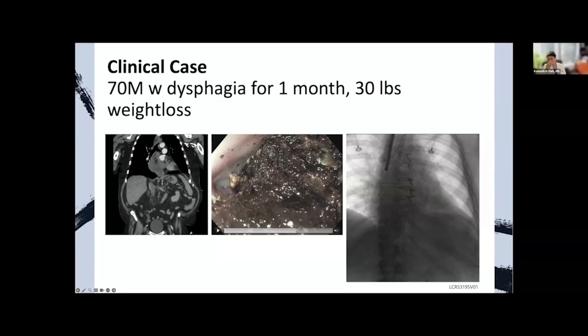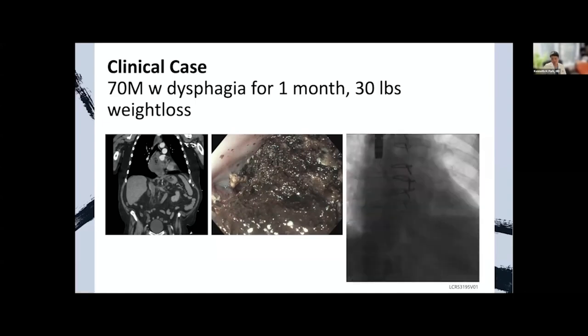So in these kinds of situations, it's absolutely necessary to have fluoroscopy. Here we're using an upper scope, and this is when you start utilizing your biliary cannulation techniques. Basically, you're trying to find a lumen in this tight area using that soft tip and spinning it without forcing anything hard onto it, because obviously the tumor is very friable, and you don't want to create a new fistula into the mediastinum. And for sure, you don't want to put a self-expanding metal stent into a mediastinum. So here, fluoroscopy speaks louder.